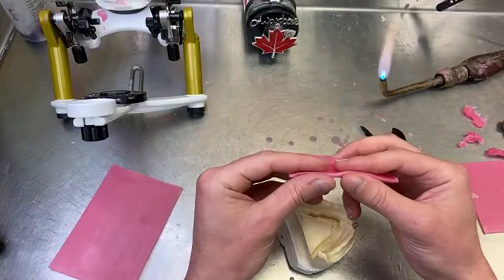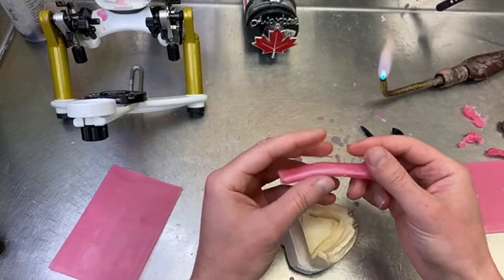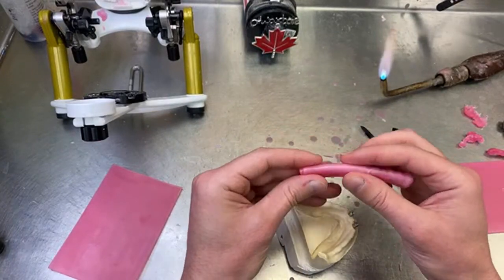So with this here, I like to heat it up, not too much that it actually starts. Well, see here, I heat it up too much that it's white.